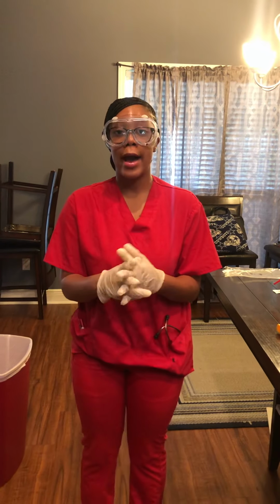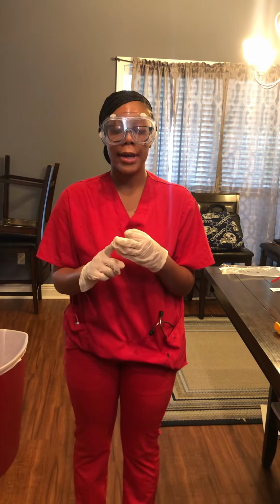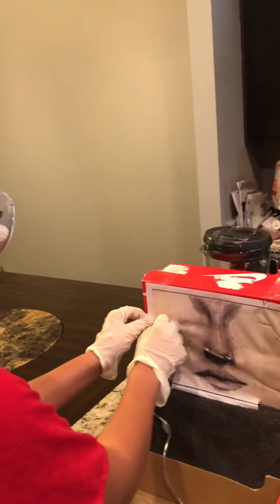After explaining the procedure to my patient, I will make sure that I turn off any suction that is present. I will make sure to undo any clipping to the gown, and I will remove any tape from my patient's nose. I will ask my patient to hold and take a deep breath. And now I will demonstrate kinking as I remove the tape from my patient's cheek or nose.